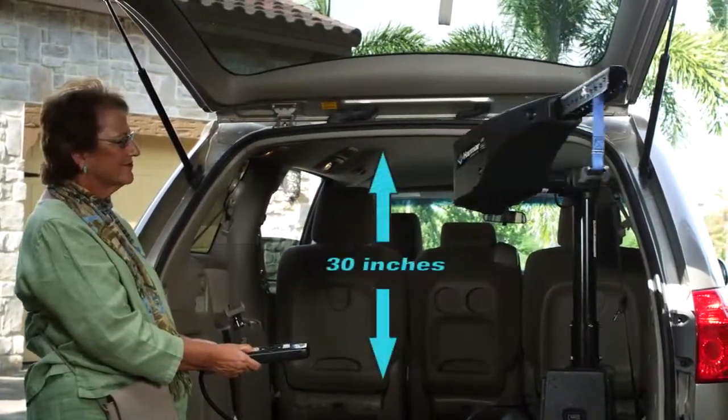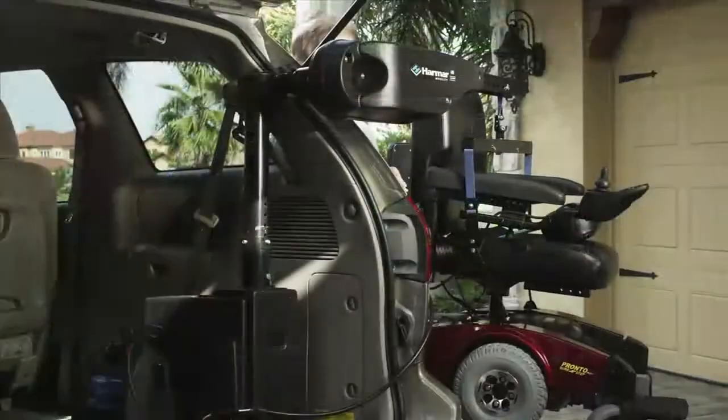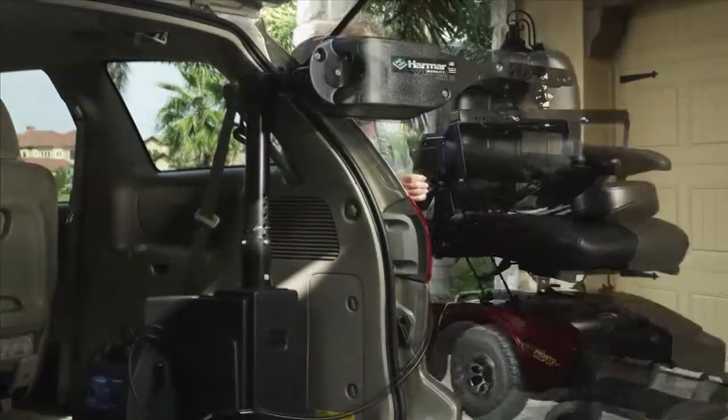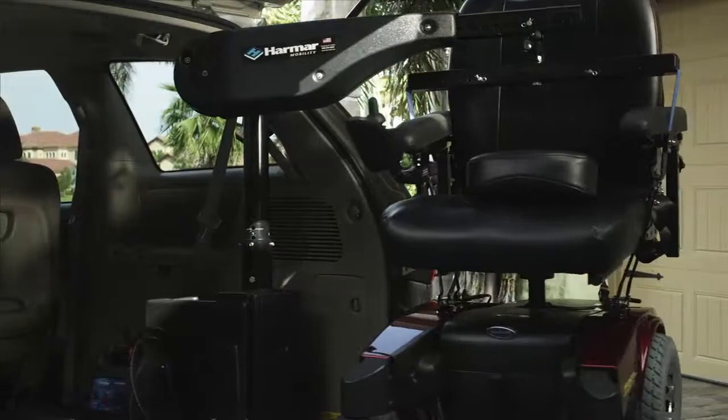This fully powered boom style lift requires only 30 inches of headroom. It easily mounts inside to work from the side or back of the vehicle. The offset post allows the lift to safely place the chair or scooter off to the side of the vehicle.